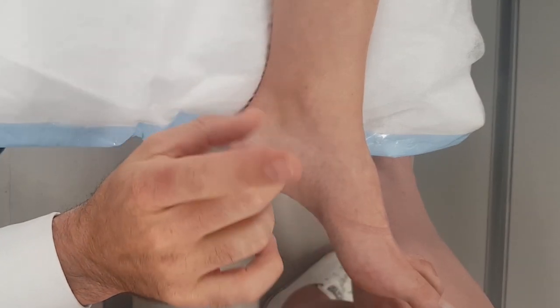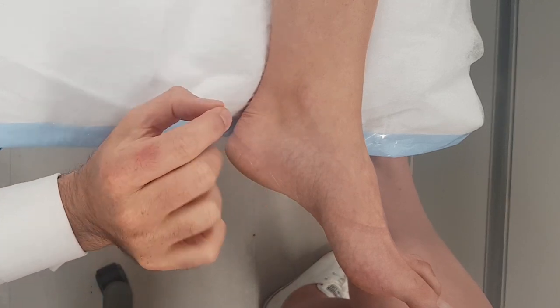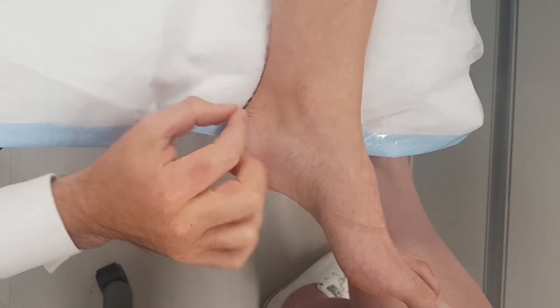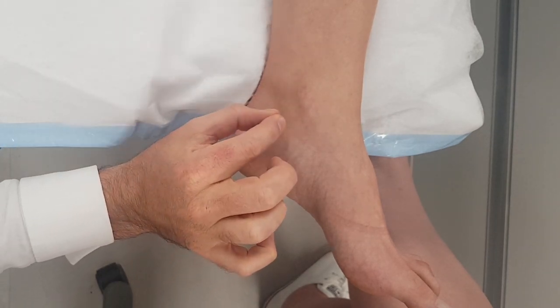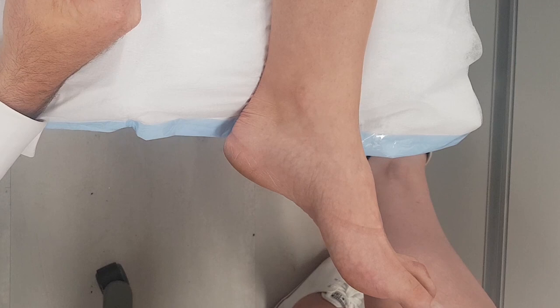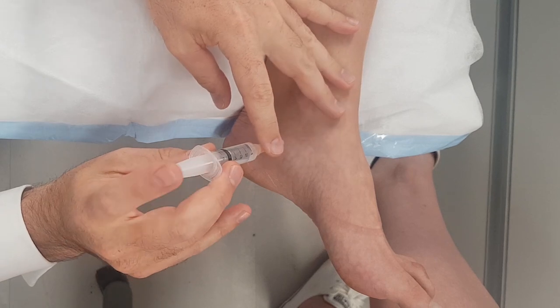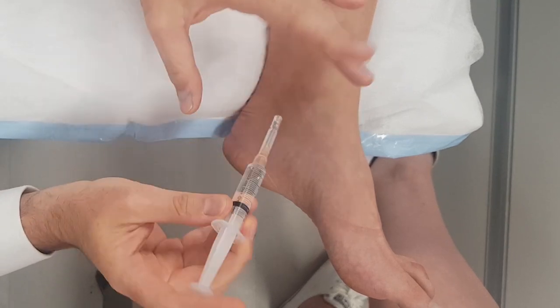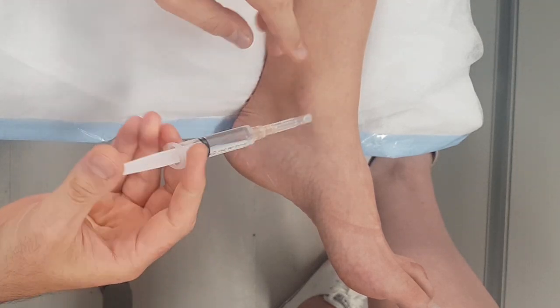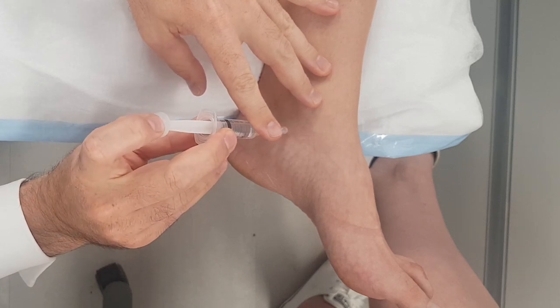So prepping the foot — Doppler, mark it, prep the foot with alcohol, go straight down. I used to go at a 45-degree angle but you don't have to. Go straight in, put local anaesthetic as you're going down. You're going to advance very, very slowly — most of the time you will not hit the artery. You can stabilise the syringe using both hands, make a little tripod, and inject little bit by little bit.